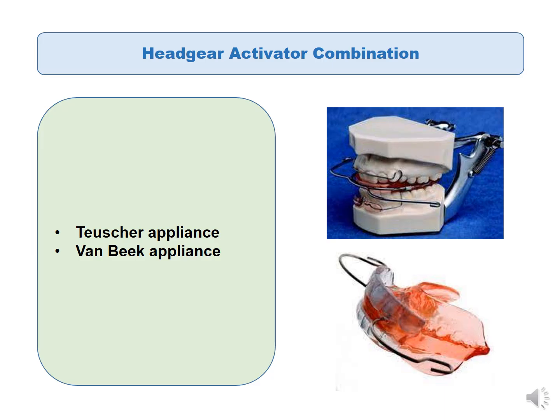Now the activator can also be modified to accommodate headgear for orthopedic action as well, and two examples of these are the Teuscher appliance and the Van Beek appliance.